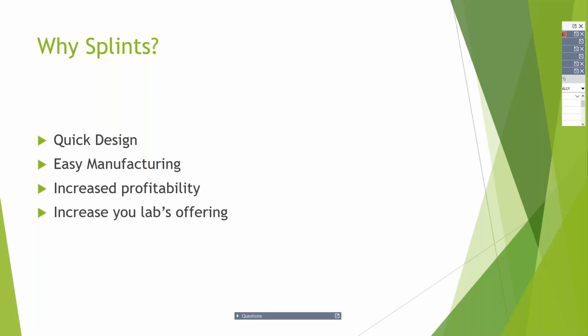So there's a lot of profitability here for laboratories, which is always a plus. And also finally, you can simply increase your lab's offering. So you can make your laboratory more appealing to a wider range of doctors and practices. The more you can offer them, the more benefit there is for them to send to you. So that's also a really big key point as to why you might want to consider diving into splints.